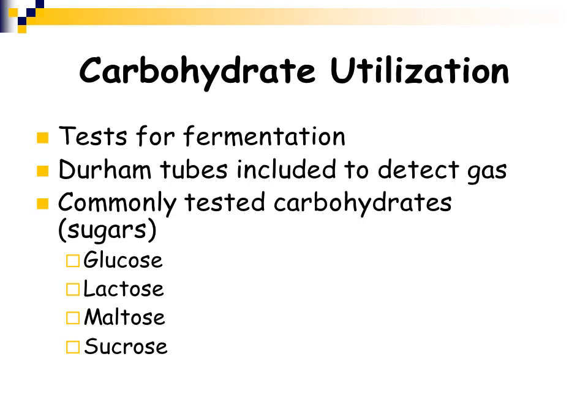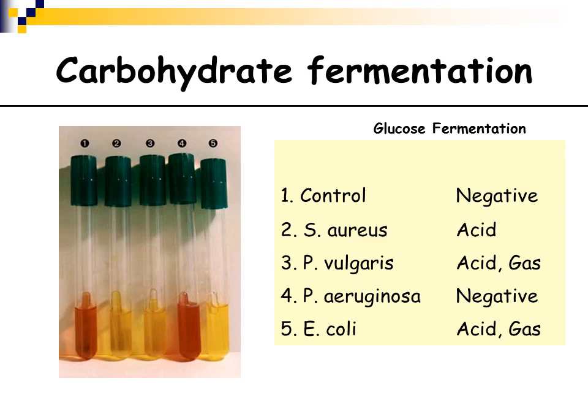a sugar. Now, these tubes used to be used a long time ago. They're not used in a clinical laboratory anymore. We have our selective and differential media now, and those media will allow you to detect the common carbohydrates that bacteria will ferment. Now in this slide, you have carbohydrate fermentation test tubes with the Durham tube in it.